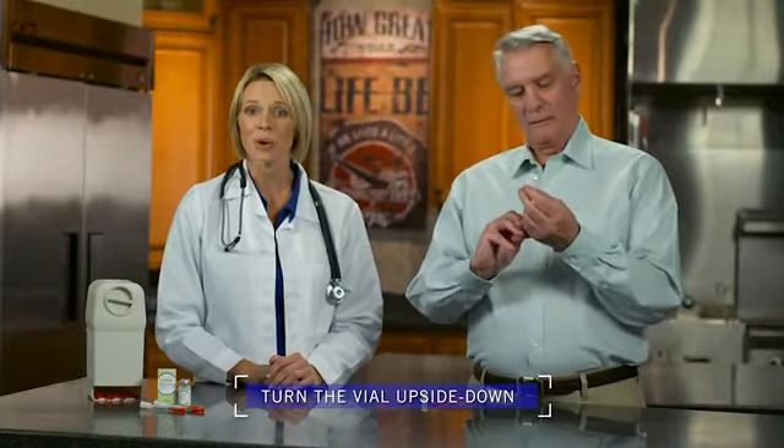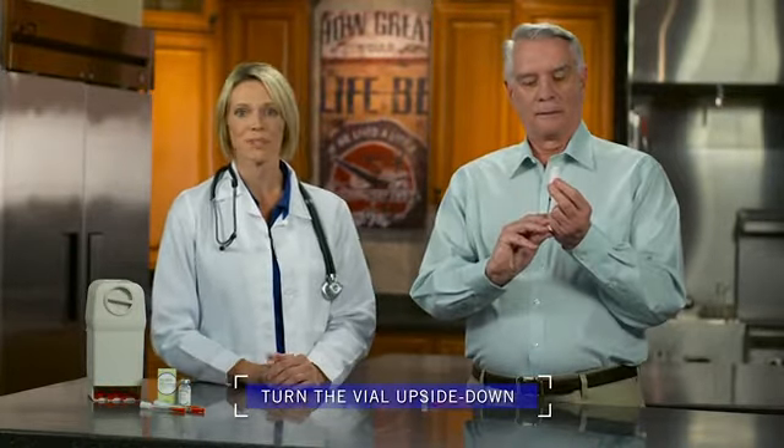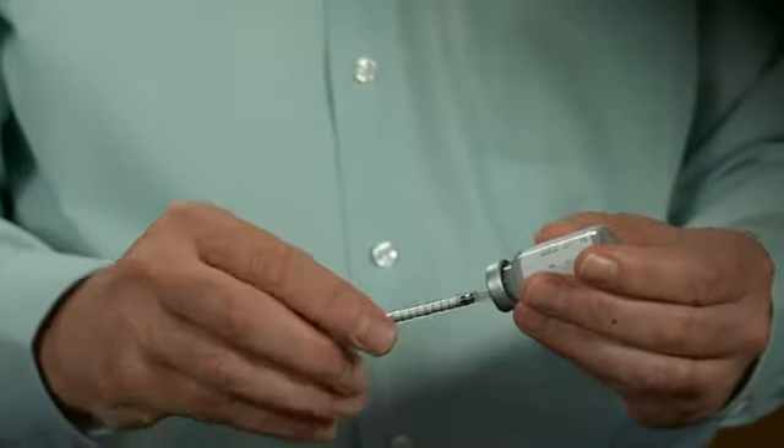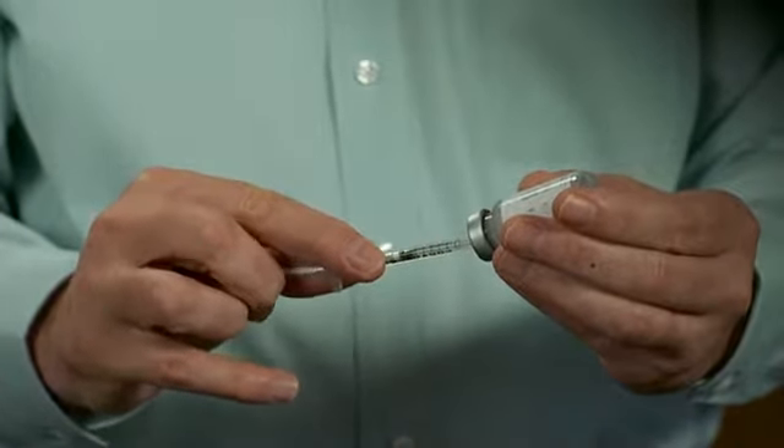With the needle still inserted, turn the vial upside down. Look to make sure the tip of the needle is all the way submerged into the liquid so that you won't draw any air into the syringe. Now slowly pull back the plunger again, but this time go a few units past the dose. You can see that Tom is drawing about seven units into the syringe.